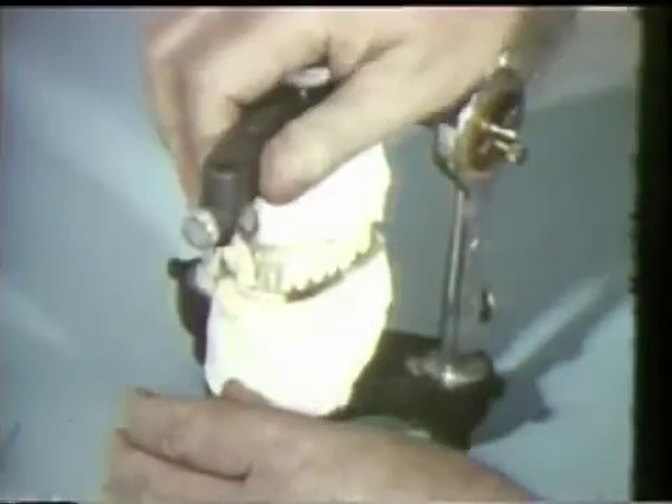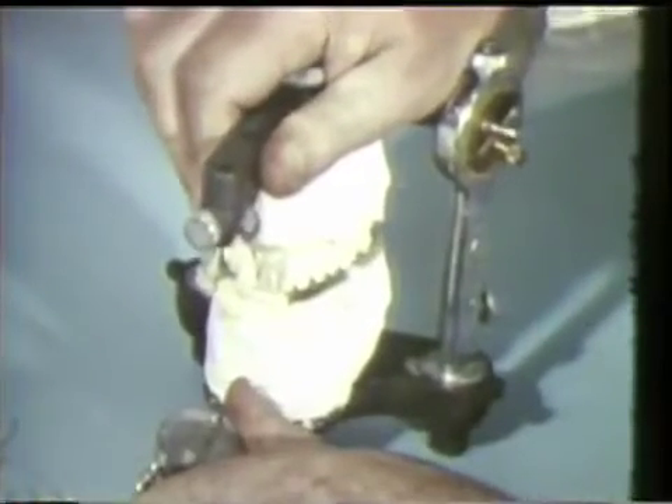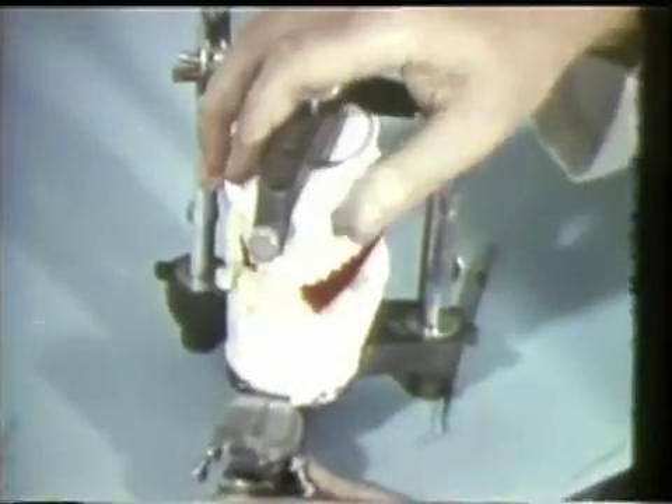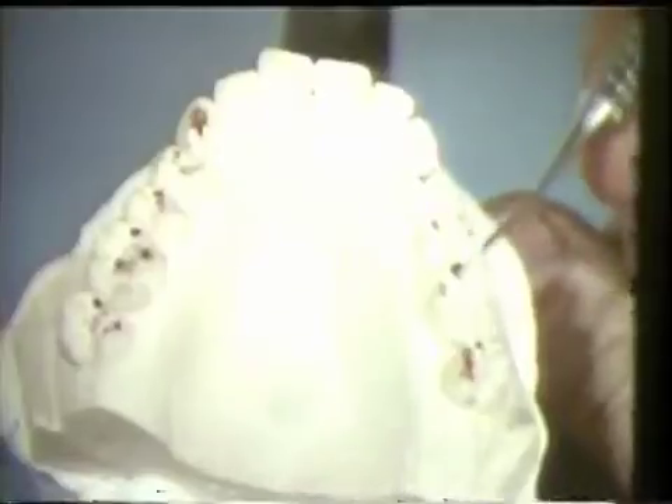The same right excursive movements can be repeated on the articulator. The working side contact on the cuspid and the balancing contact on the second molar are evident. The same movement is repeated with red dental ribbon. The markings indicate rubbing contacts on the right cuspid and the lingual cusp of the left maxillary molar against the left mandibular molar and cuspid.